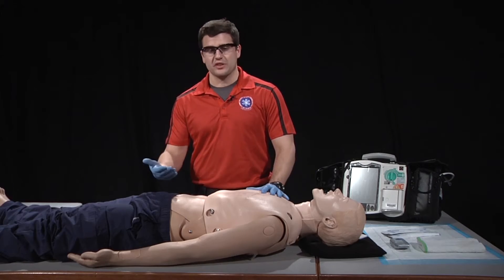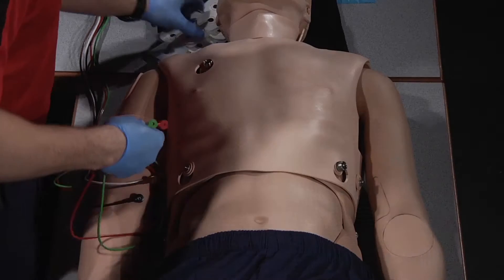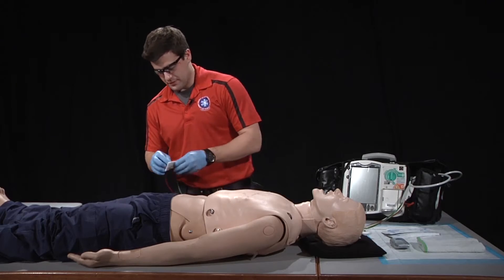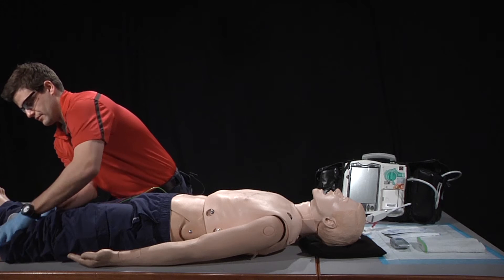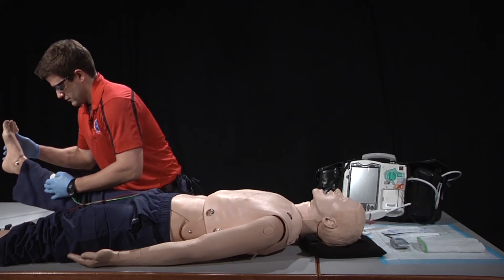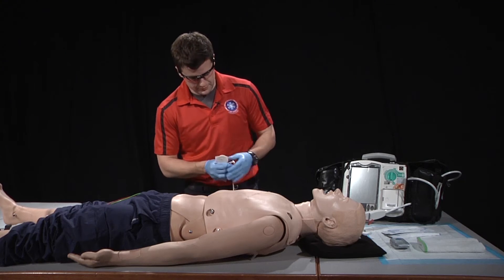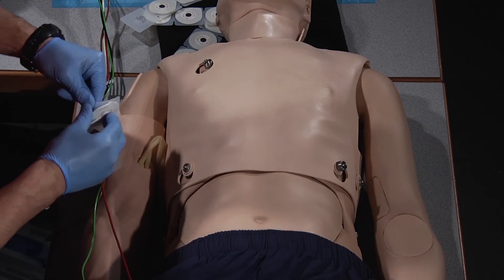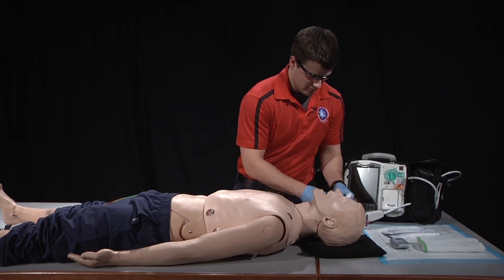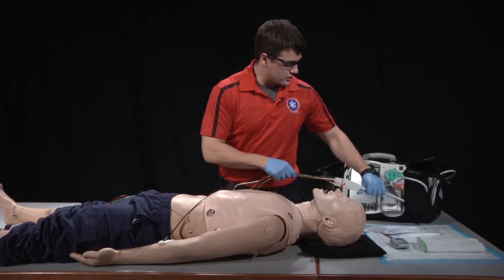Now that our patient has been prepped, it's time to put the limb leads on. We're going to be placing the limb leads on the medial side of the calves and the medial sides of the forearms. Once our limb leads have been placed, we can go ahead and place our precordial leads.